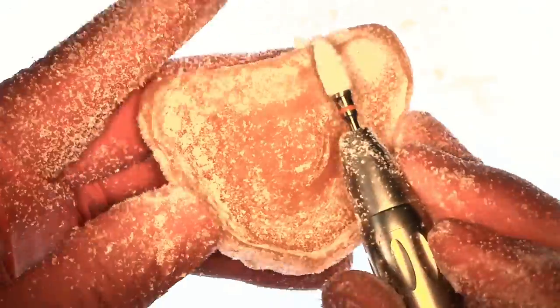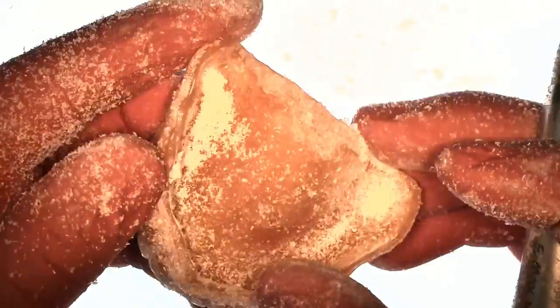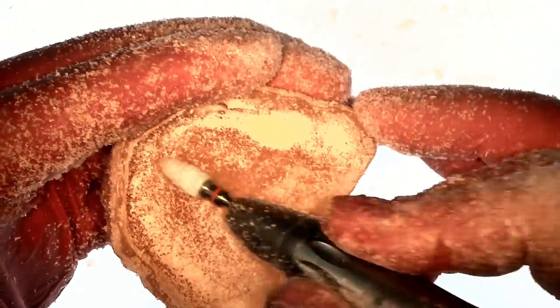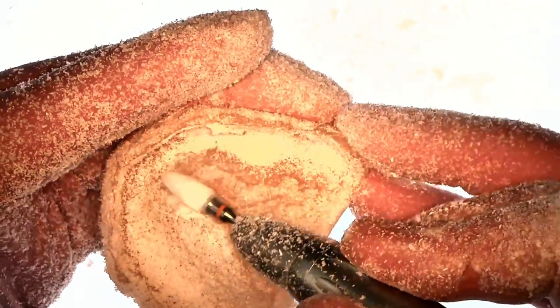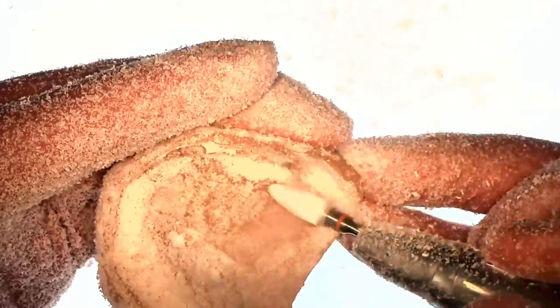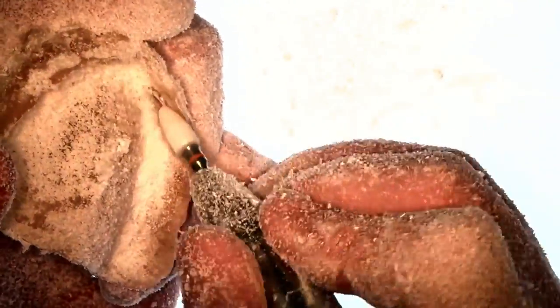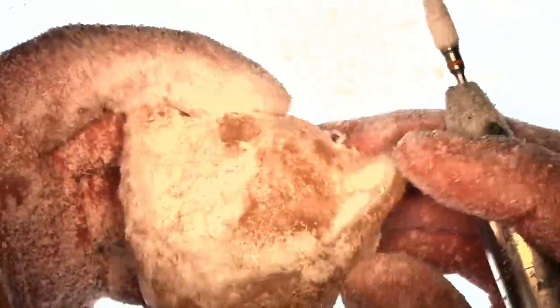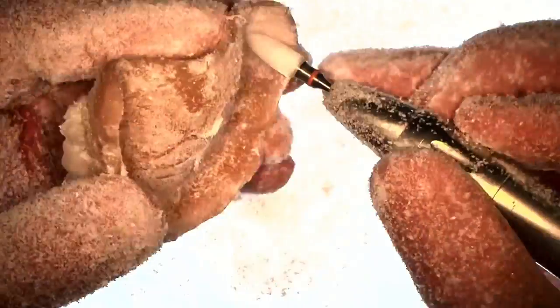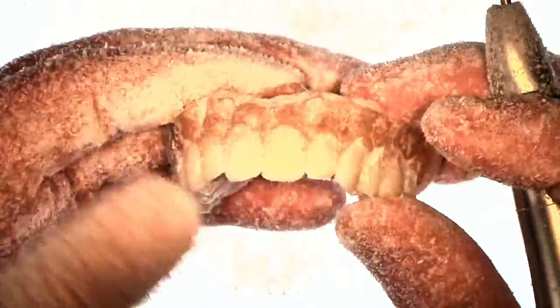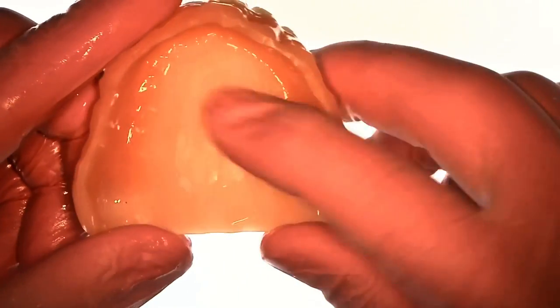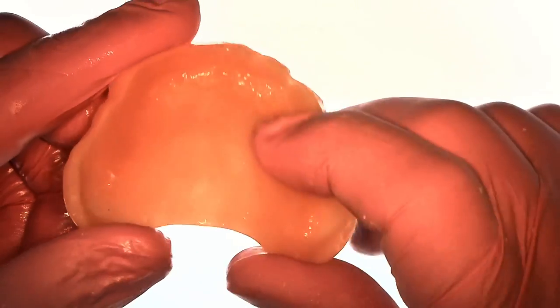The next thing that I do with the same burr is I'm going to relieve the surface of the intaglio of the denture. This is in this instance a permanent soft reline here for a printed Flexera denture. If you were doing an immediate denture oftentimes you do not need to reline the intaglio surface because you're already going to get shrinkage of the soft tissues so you already have that space.